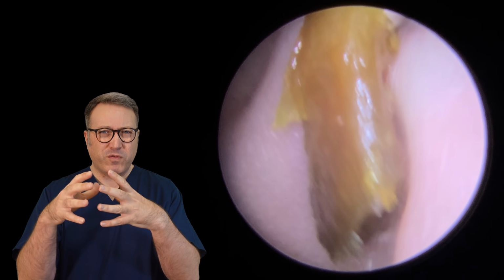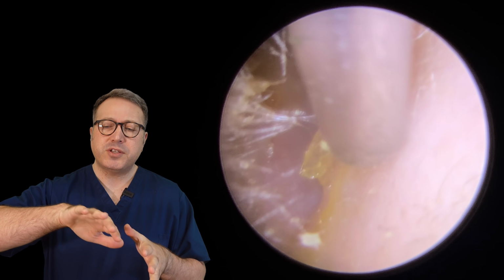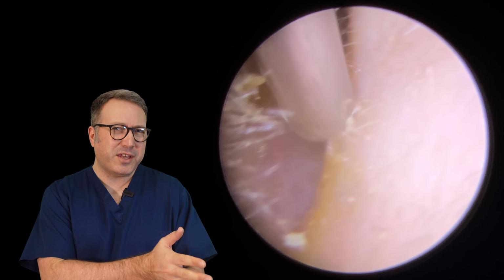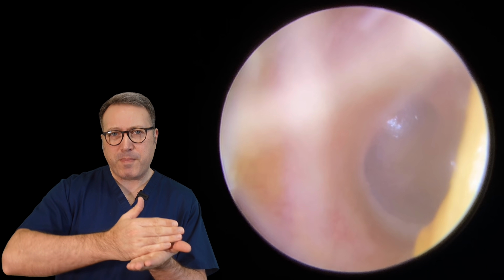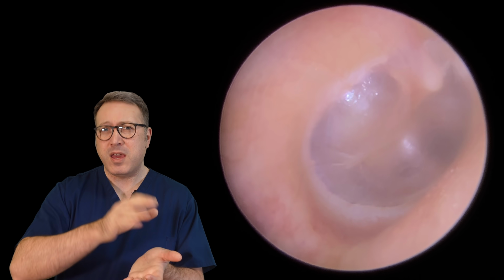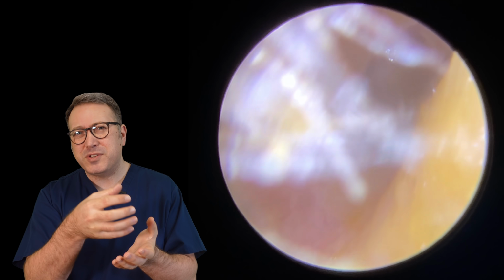This very oval shape to the plug as well, rather than that round ball shape we normally get. You can also see there's a bit of loose skin to the right. There's also a little bit of loose skin to the left canal wall as well. So we're just drawing the suction tube along the back of that skin just to try and chip that away. Eardrum there is looking really healthy. We can see a little bit of loose skin to the left side.